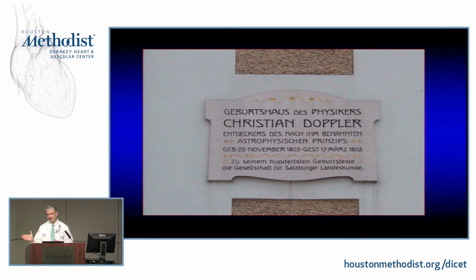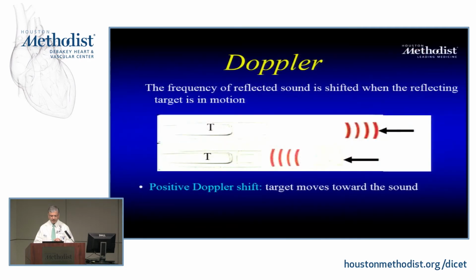Okay? Just imagine this conglomerate of power of art, music, physics. And the way he figured this one out, the Doppler equation, is by observing, there was not much pollution then, the stars getting closer to each other or not. There's a Doppler shift that occurs. Just imagine, he was able to construct the Doppler equation. And we'll talk about the Doppler equation.